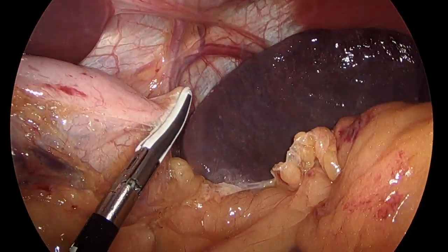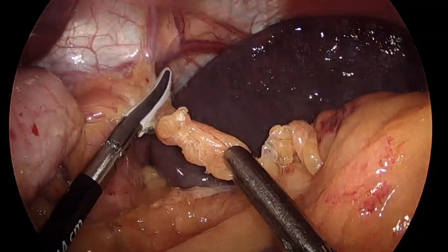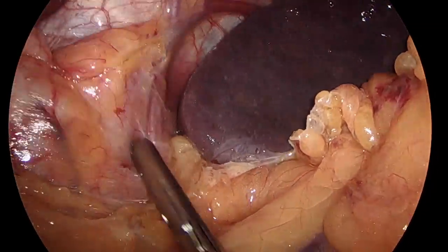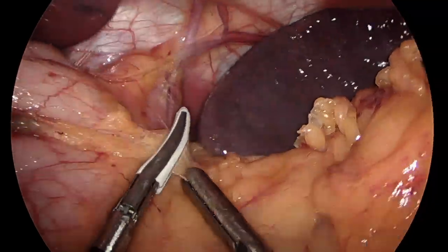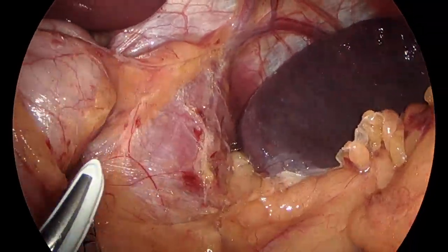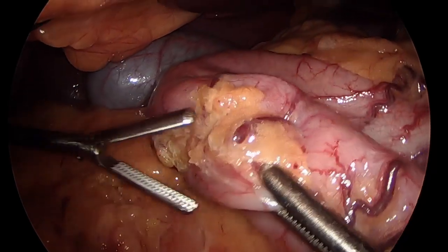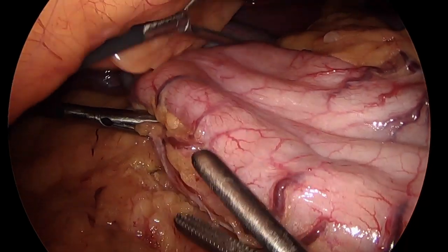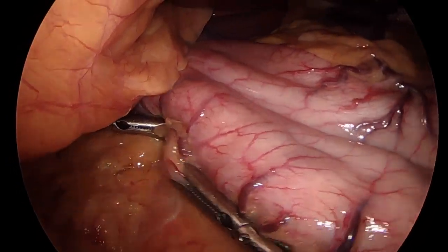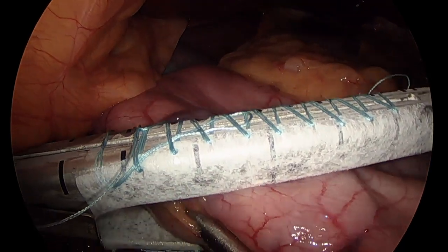Next, we transition to dissecting the phrenoesophageal capsule and separating the angle of His fibers from the left crus. The inferior phrenic artery becomes visible during this part of the dissection. In some cases, there is a significant arterial branch that comes off the inferior phrenic artery and feeds directly into the GE junction. If possible, this branch is preserved in order to minimize the risk of ischemia to the gastroesophageal junction, where the majority of leaks during sleeve gastrectomy occur. The gastric stapling begins at the junction where the gastric tissue transitions from disorganized to organized propulsion of ingested food, which is typically the junction between the antrum and the body of the stomach, usually visible on the greater curvature at approximately 3 to 6 centimeters from the pylorus. The antrum and pyloric pump are preserved so that this portion of the stomach can quickly expel food into the duodenum, thereby driving the bariatric effect of the sleeve procedure.